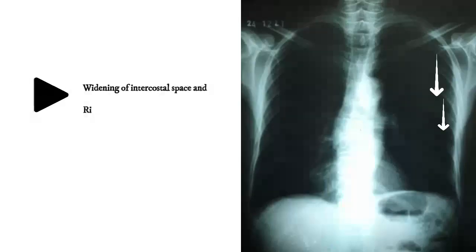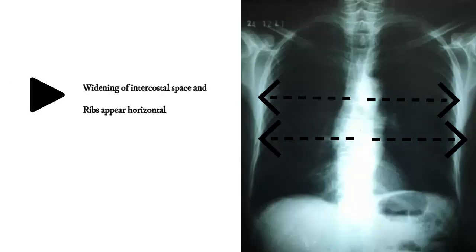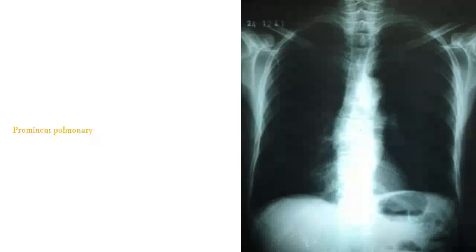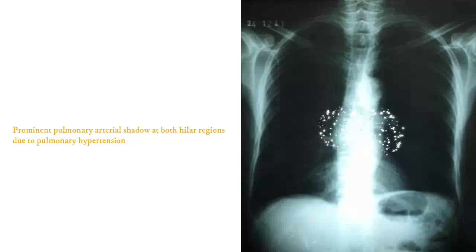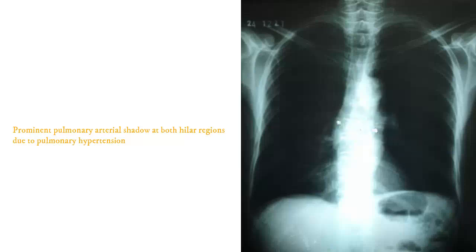Widening of the intercostal space, and ribs appear horizontal on chest X-ray. There is also a prominent pulmonary arterial shadow at both hilar regions due to pulmonary hypertension.